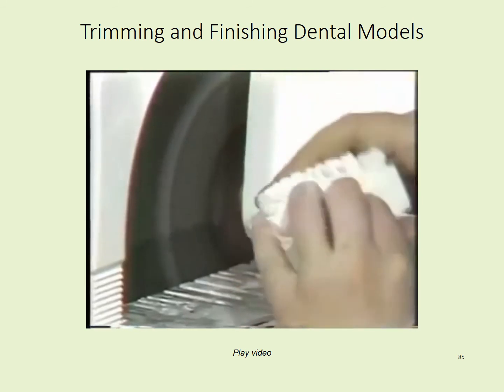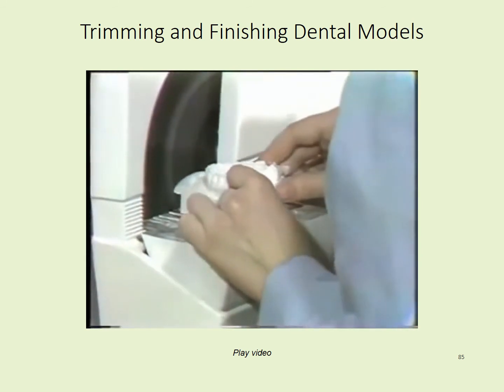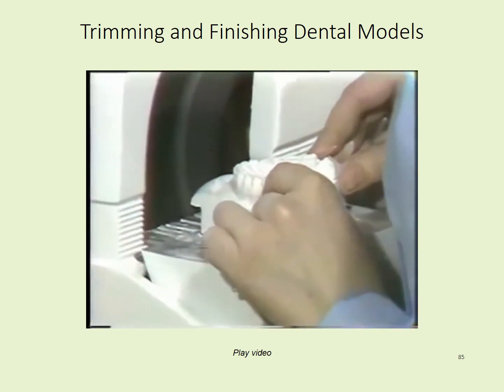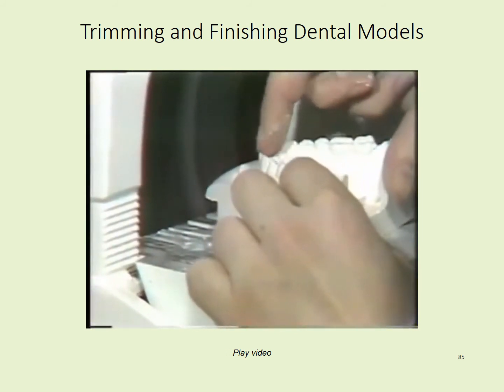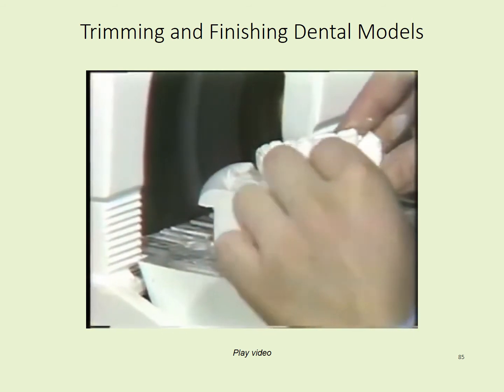After the sides are trimmed, you should trim the arc. The arc should be a semicircle concentric to a circle that would be drawn through the facial surfaces of your anterior teeth.